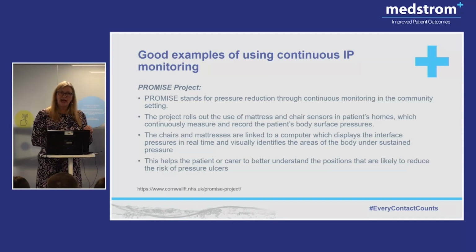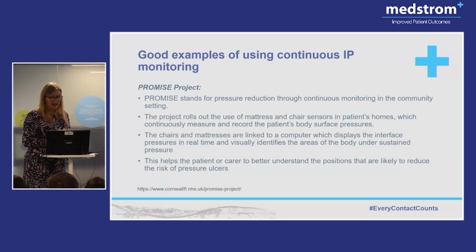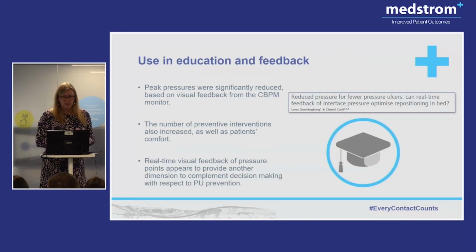She left it for 48 hours and she showed them, if you cross your legs, this is what happens. If you move your arm, this is what happens. If you sit up and read, this is what happens. And do you know what? Every single patient accepted their mattress because they worked to find the right one for that person, and it made a huge difference.